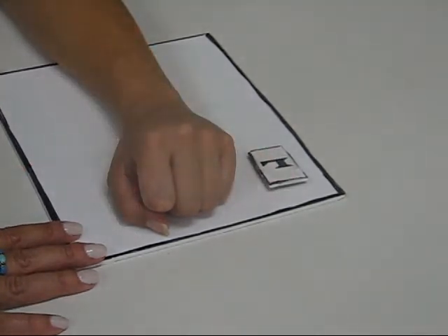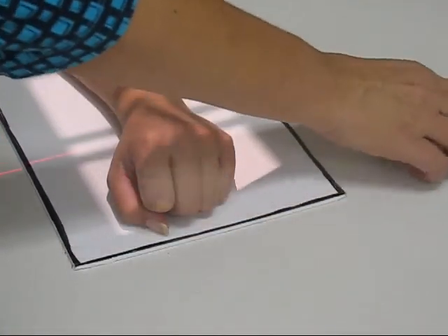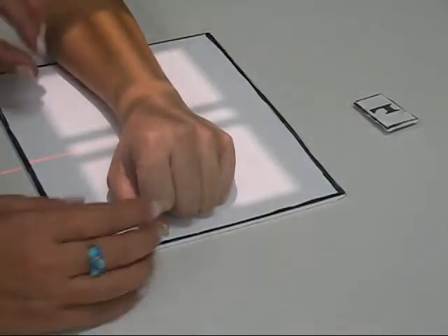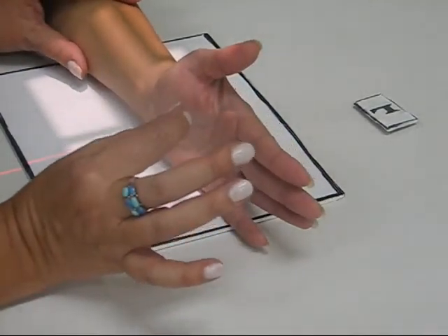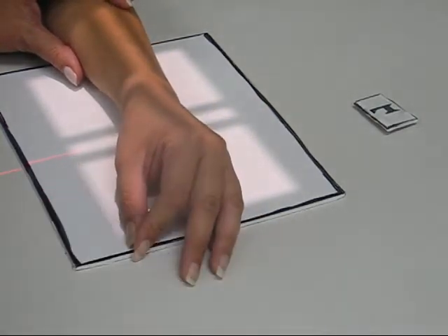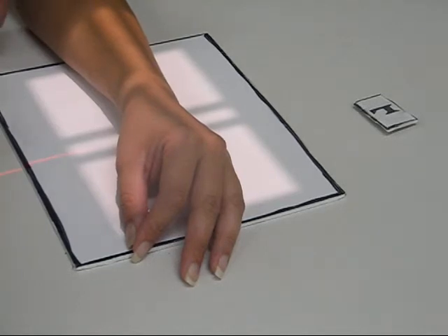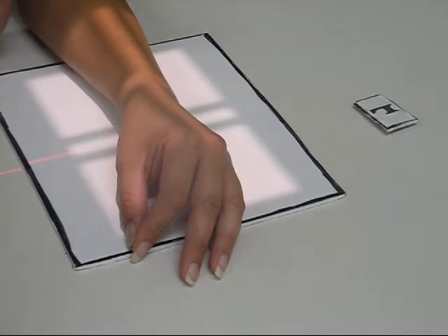The oblique position of the wrist, you accomplish it the exact same way as you do the hand. So go ahead, open your hand, touch these two fingers together and let them fall on the cassette. Okay? You have a perfect oblique position of the wrist with a 45-degree angle to the image receptor.